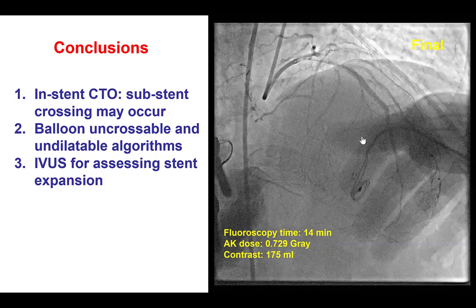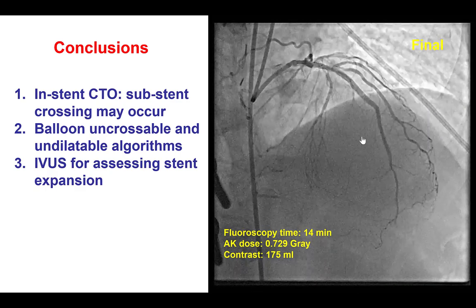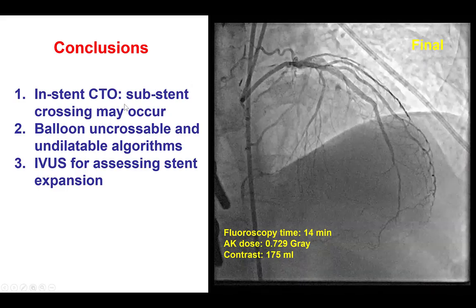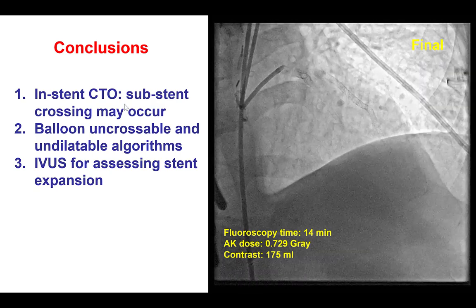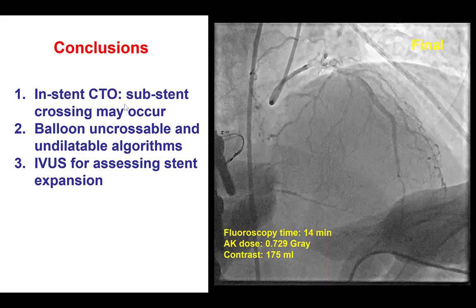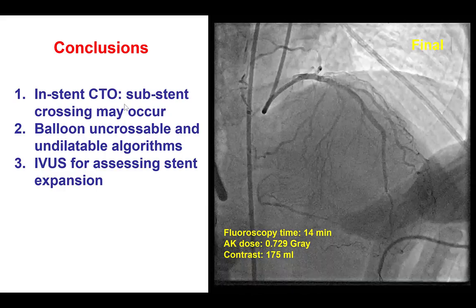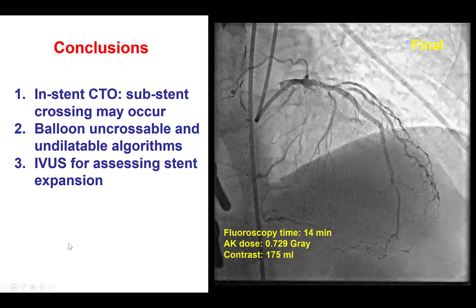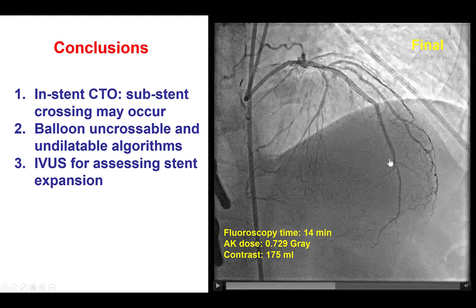This was the final result, with good TIMI flow into the LAD, and a plan for a staged procedure for the right coronary artery as well as the circumflex. In summary, if there is resistance in crossing through a previous stent after wiring, this could be due to sub-stent wire course. The way to correct this might be to wire with another wire, or potentially wire with a knuckle-wire, which is less likely to go under the stent struts. If that is not feasible — as in our case where we did not want to lose wire position — an alternative is to crush that portion of the stent and then use another stent to restore antegrade flow.